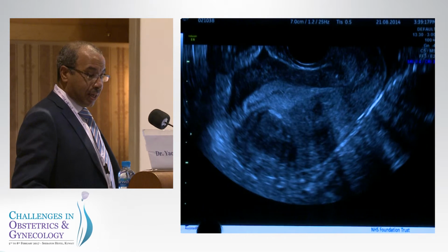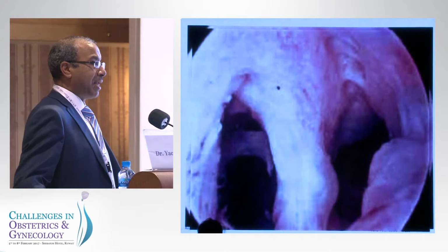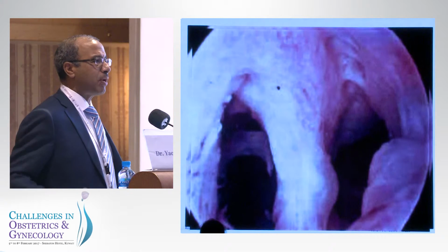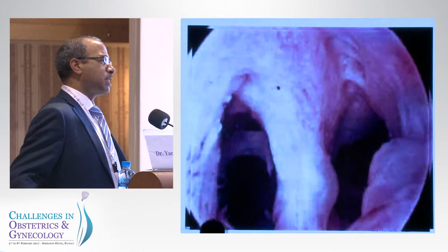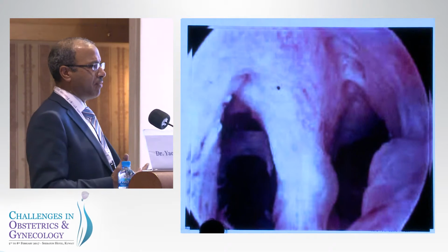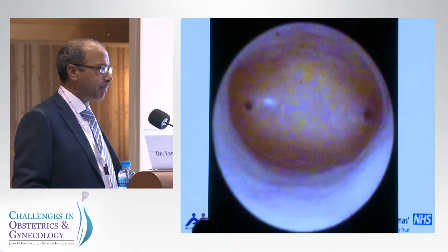And structural anomalies where hysteroscopy comes in, like intrauterine septum. Again, that is something for which we don't have a really strong evidence base for its removal, but expert opinion currently, considering the patient will go through emotionally demanding and expensive treatment, is that it makes sense to safely remove an intrauterine septum before undergoing IVF treatment.